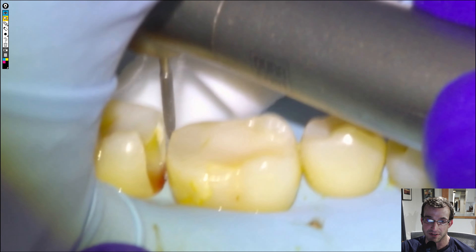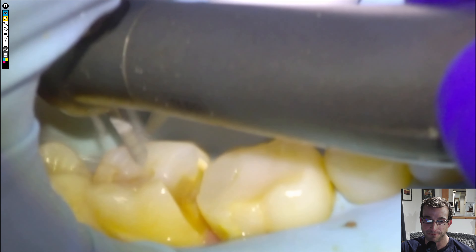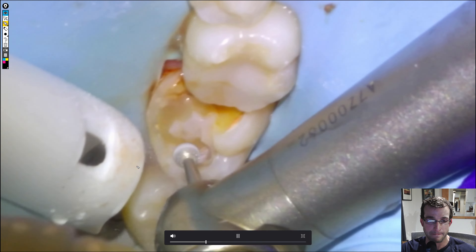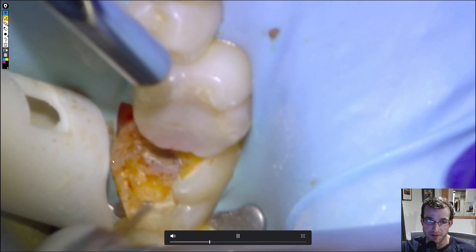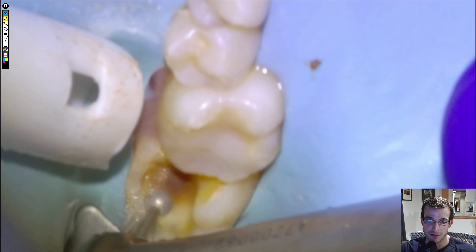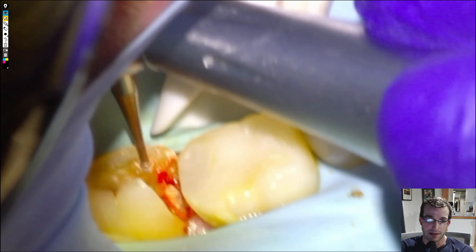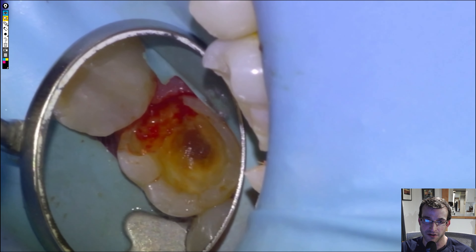Use a flame bur to round off sharp corners of the box. Snip the septum so it doesn't get in the way, and then continue removing the old composite material. There's mid-prep — still got a ways to go. Still more composite there, so we're going to continue with the large round. And we'll start using our slow speed, our small carbide, getting all the soft tooth tissue out of there until we're back on hard tooth tissue everywhere.